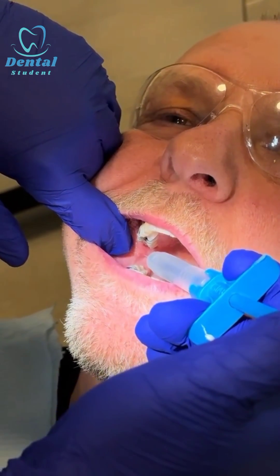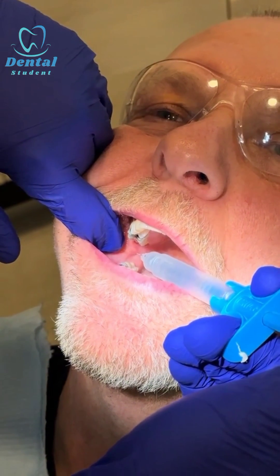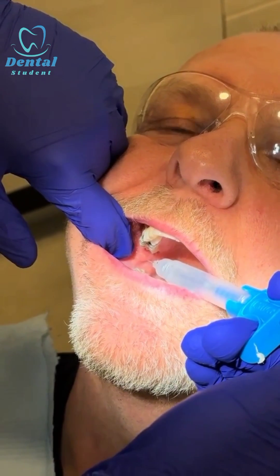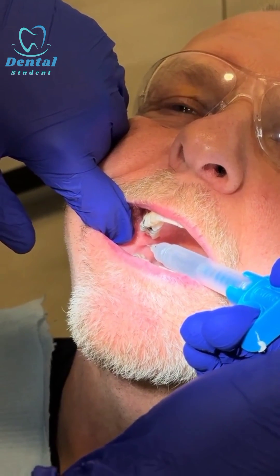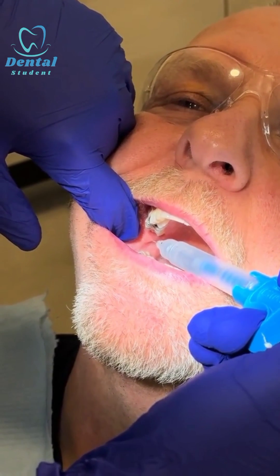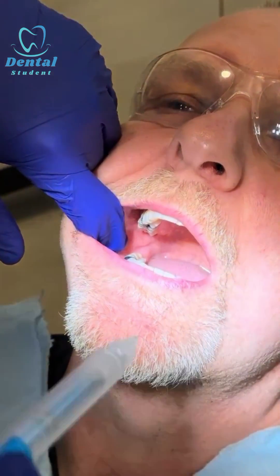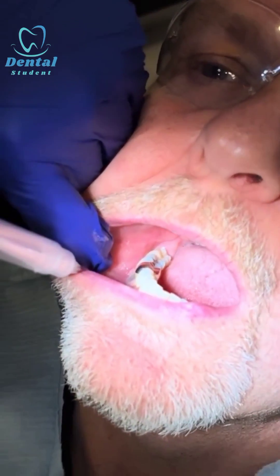Then I go in — I always leave about a few millimeters of the needle outside the tissue — and I inject very slowly. That's the first one for the ID nerve block. Then I withdraw the needle halfway for the lingual, as you can see. And then the last little bit is infiltration next to the tooth to be extracted — sharp scratch.